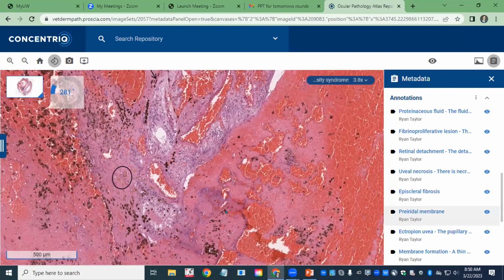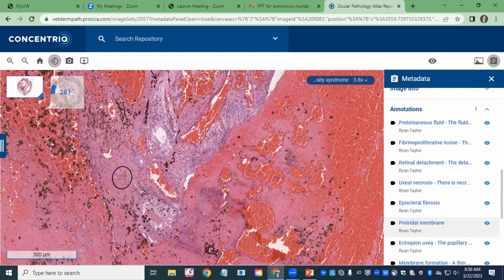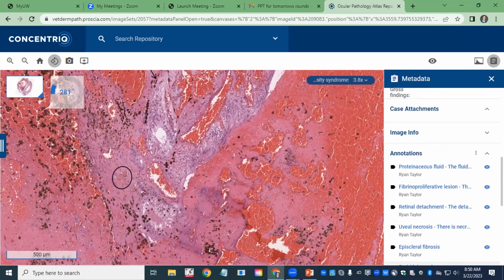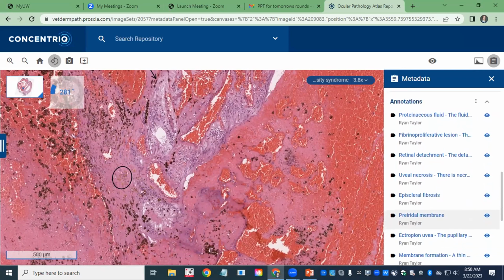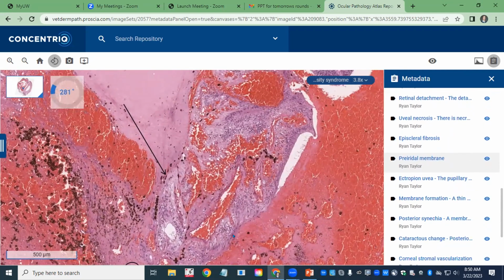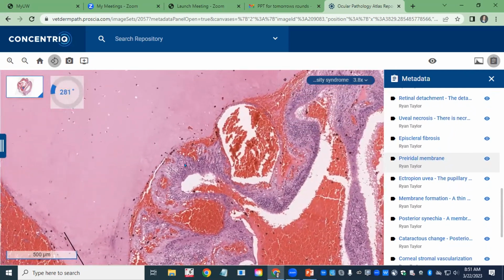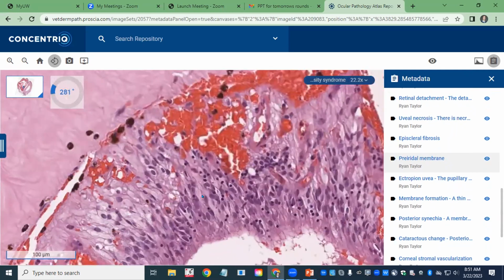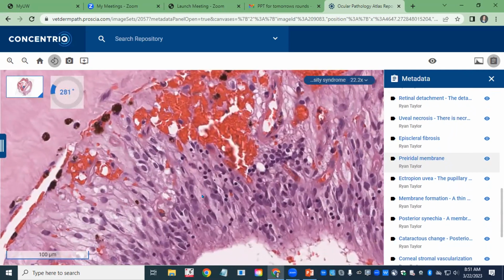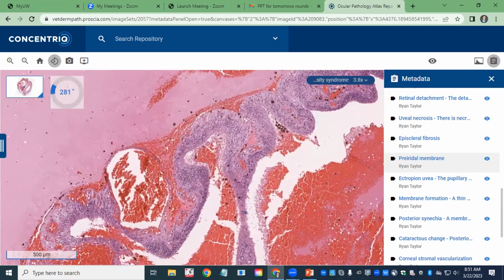But all that being said, I really thought that there was a retinal necrosis. I really struggled convincing myself of retinal necrosis in this case, in the sense of finding good necrosis of the nuclear layer. I believe there's retinal necrosis. I just don't know if it manifested well histologically on this slide. If you see a different spot, I will add it.